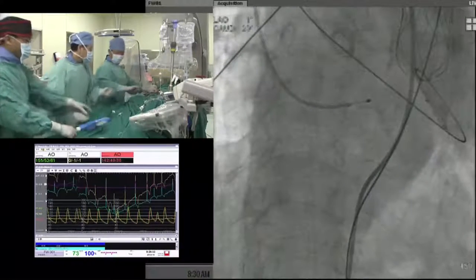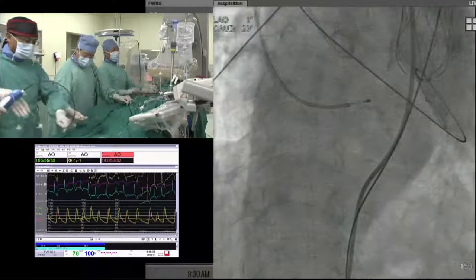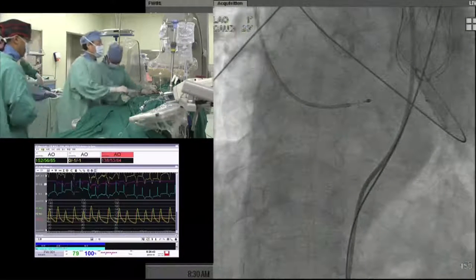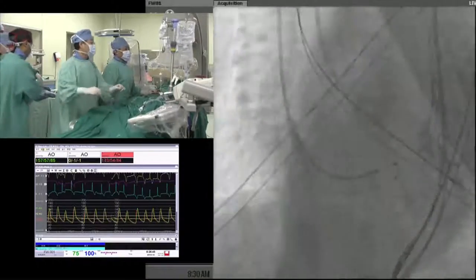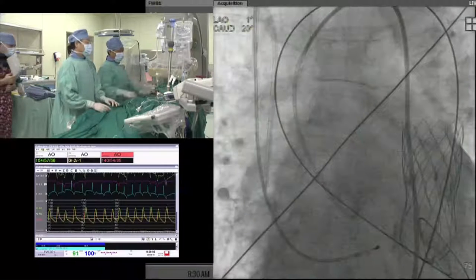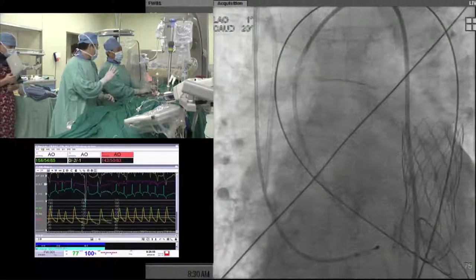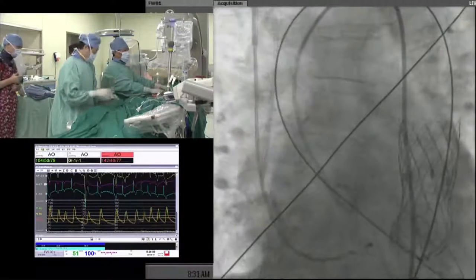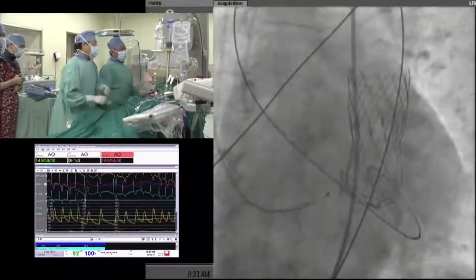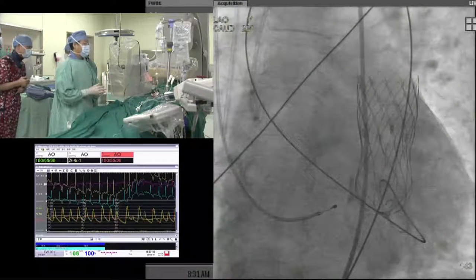Okay. What's next? So I think we should make a predilation. It's a two-step. For us non-engineers, it must be some combination of the shape memory, all that stuff is not easy to figure out, meaning exactly the right strength. Maybe we'll confirm. This one clearly doesn't have much radial strength to expand when you're inside of it. I mean, it's constrained, but it really wasn't expanding at all. Yeah, I don't know how it compares to CoreValve, for instance, in terms of the radial strength when it's just beginning to be inflated.